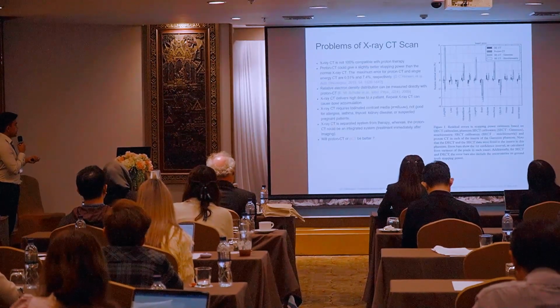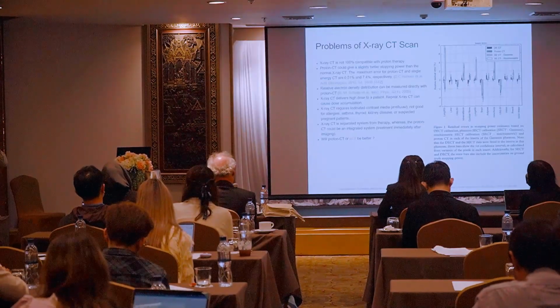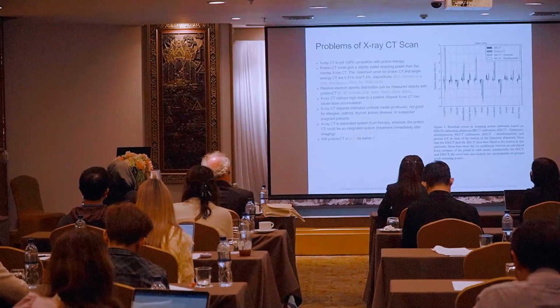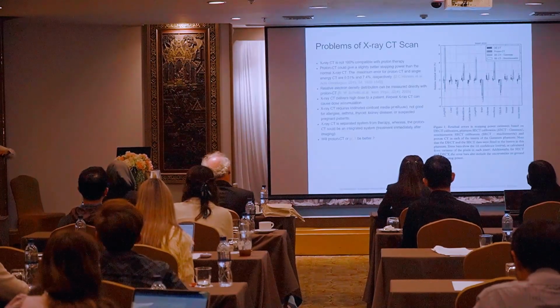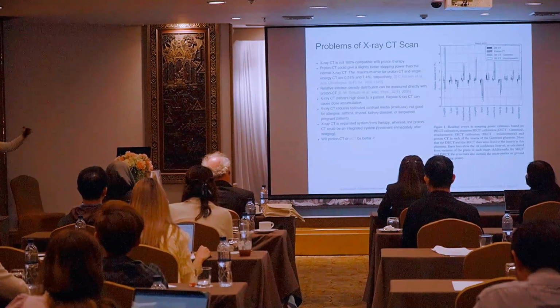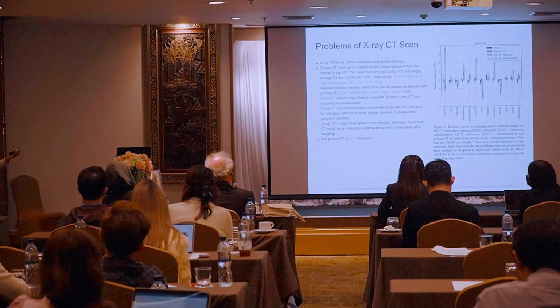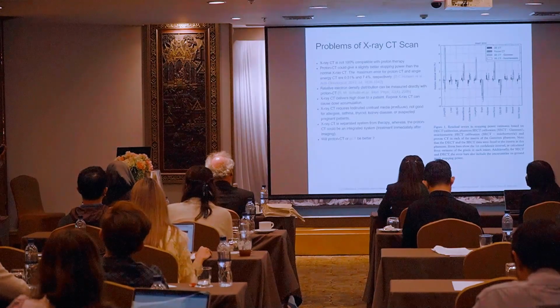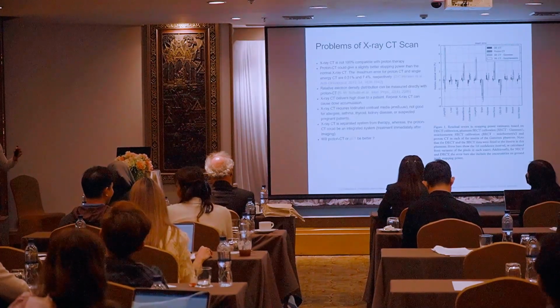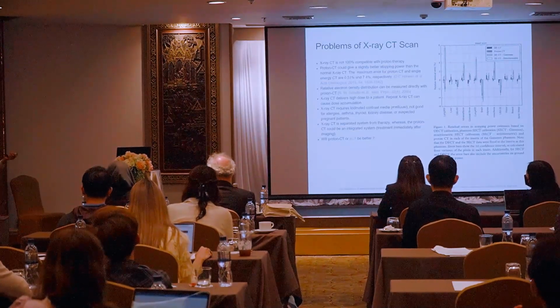The next thing is, for the X-ray CT, when the doctor asks you to do the X-ray CT, you have to do it today, and then the next week or some other day you will do the proton therapy. This means there is some time in between, right? But if you have the proton CT, you can just do it 5 minutes before the treatment. Maybe I exaggerate, but won't it be better, because we use the same machine, right? We use the proton beam.